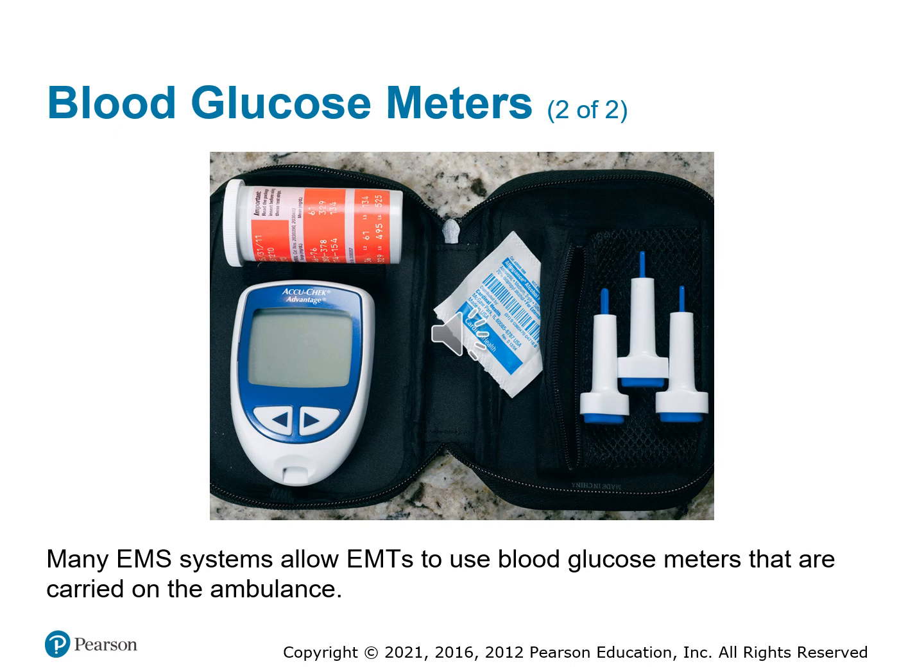As long as your protocols allow, which most do, you'll carry a glucometer. And basically what you're going to need is this equipment. The device in the lower left is going to be the actual glucose meter. Right above that is going to be the test strips. Those test strips will pop into that little notch at the bottom of the meter. And then from there, you'll basically draw some blood into the test strip.